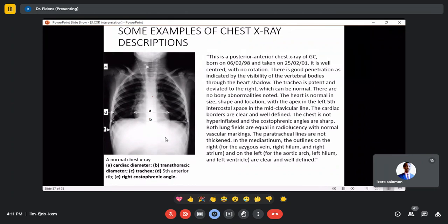Attention, penetration. Listen, in radiology we have always convincing facts. When you say over penetration, it looks like you have forgotten the criteria, the definition of over penetration. By definition, what is over penetration of the film? What is an over penetrated film? By definition.